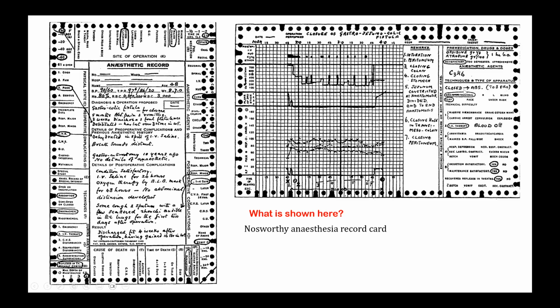What does that mean? The closed ventilation, closed circuit, which is used in the form of Waters to and fro canister. Okay, absorber with the calcium. This ABS stands for carbon dioxide absorption. With the Waters to and fro canister, they used cyclopropane, which was the common agent used for cases like those with hemodynamic instability. This was supposed to be the wonder drug. They also recorded whether blood was given or not. Every detail has been there, but all these things have to be done manually.